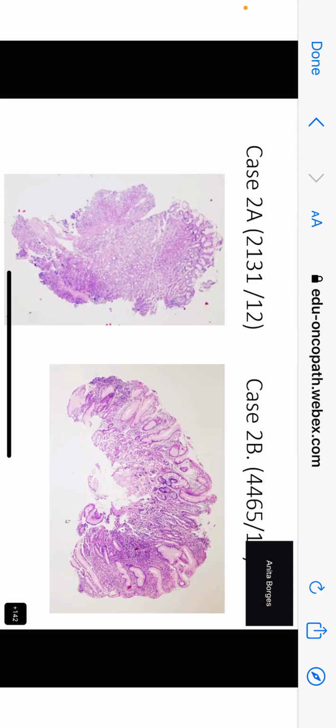All this, ma'am. That's not extravasated mucin. Okay, that's just some sort of serous exudate, or even something that's crushed by the biopsy. That's not extravasated mucin. Okay, ma'am. So nothing else you can see.